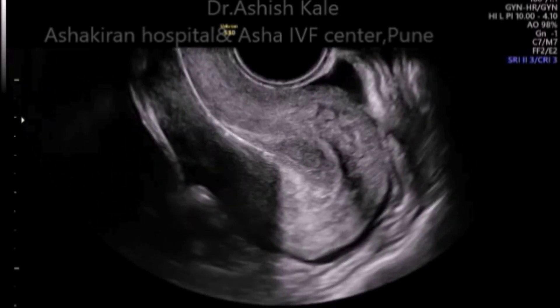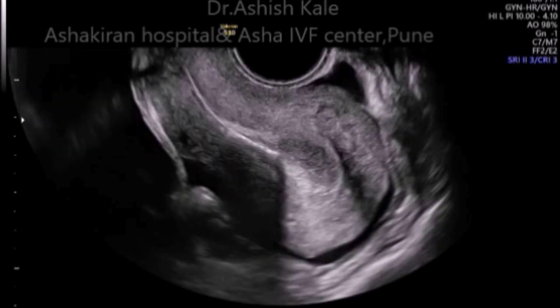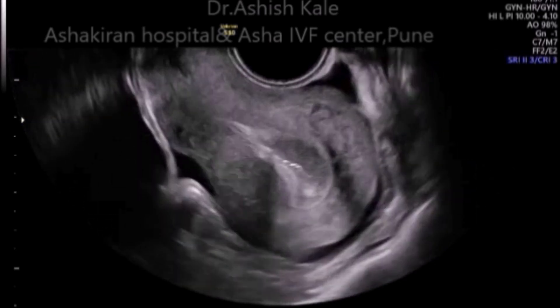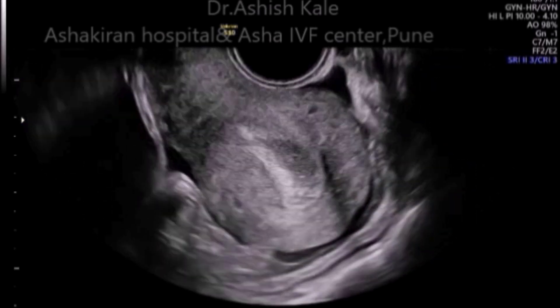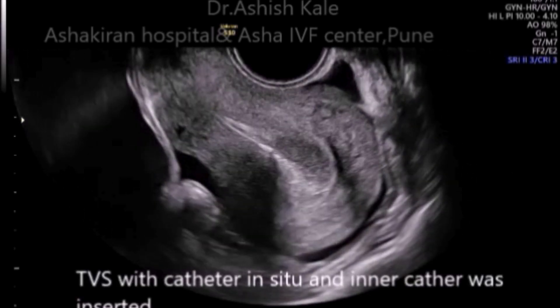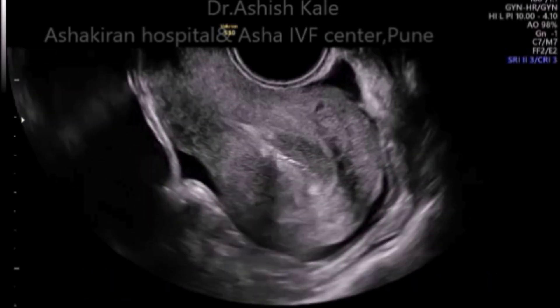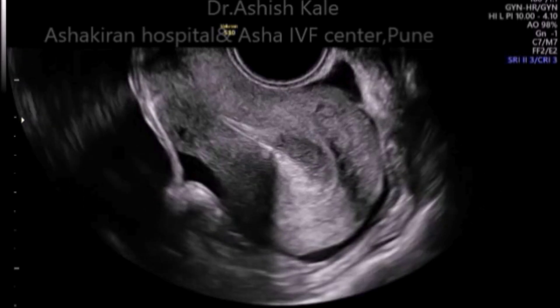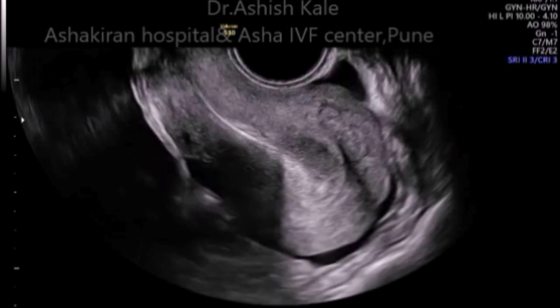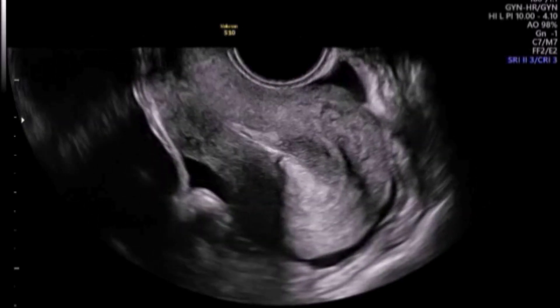This has to be double-checked by doing a 3D ultrasonography — this is what we routinely do in our center. We place the catheter with the inner catheter containing the embryos in view. We perform the embryo transfer, and 20 to 30 microliters of fluid is injected with the embryos inside. This is called the sandwich technique, which we routinely use. Once the inner catheter is visualized exactly in the center of the cavity, we proceed with embryo transfer.